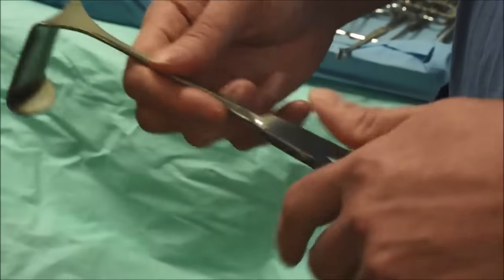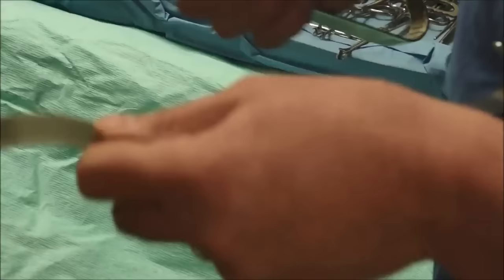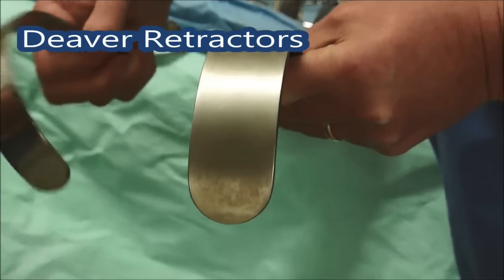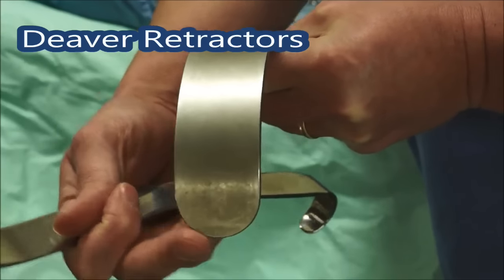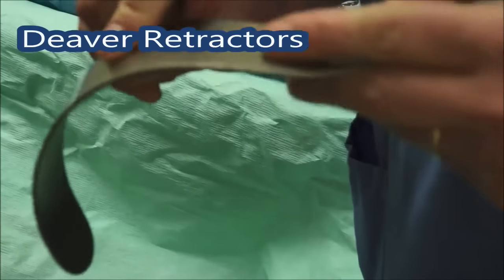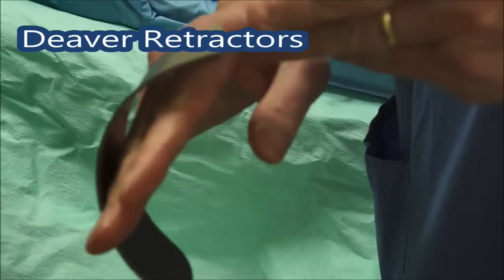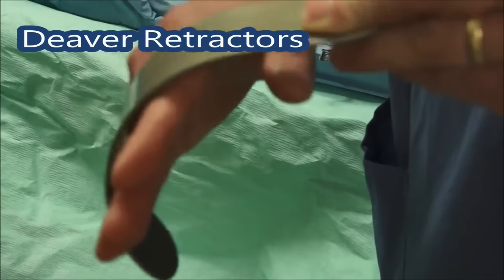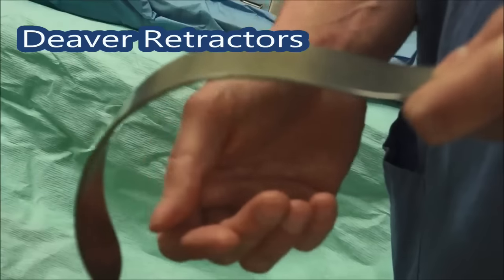Getting into deeper wounds, these two things here are called Deavers — you can see there's a narrow one and a wider one. Again they've got a round edge so they're not going to dig sharply into anything, and they're very curved so you can get underneath things. These were used a lot in open gallbladder operations where you'd put this over the costal margin and gently pull the liver back. Be careful not to dig the end in, as it can easily cause trauma to the liver — just put it in there and gently pull back. For larger patients in the abdomen these can be quite useful.